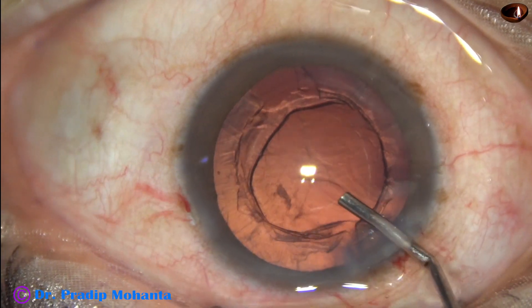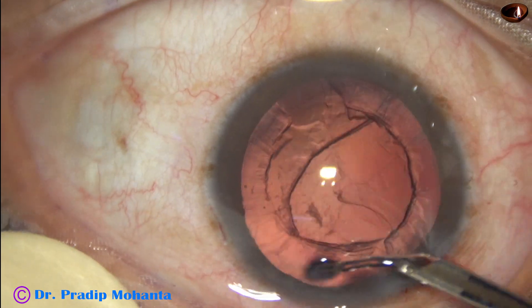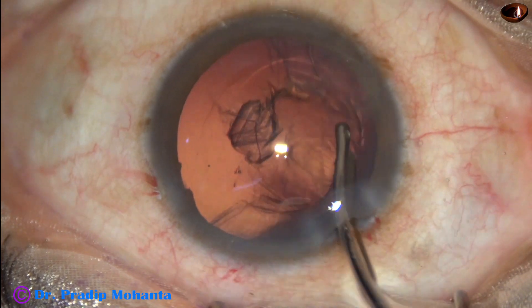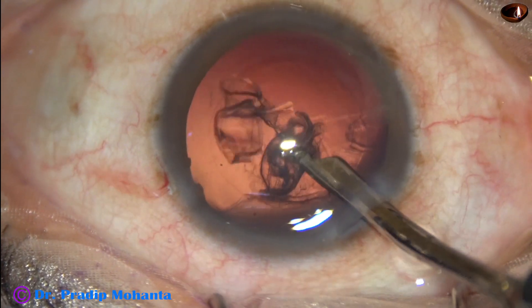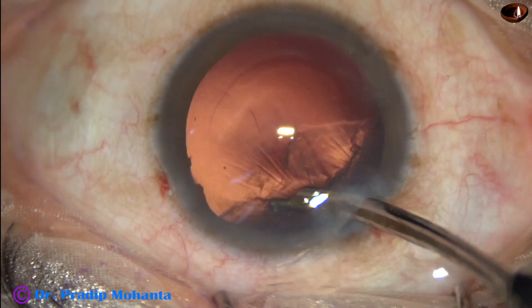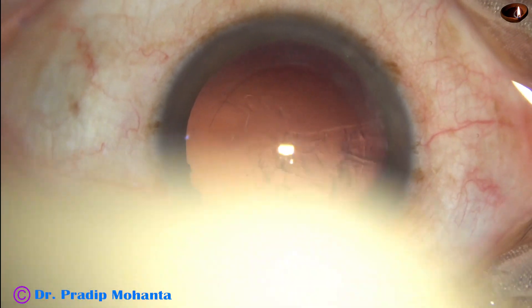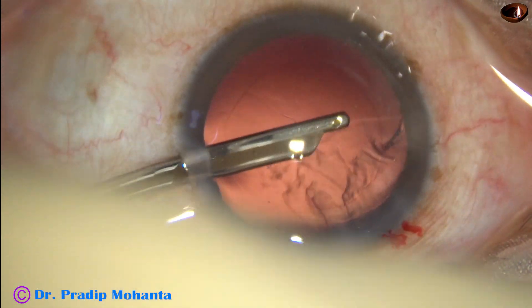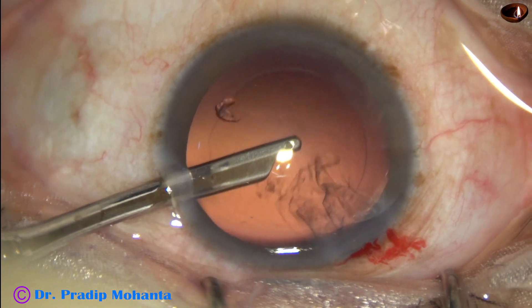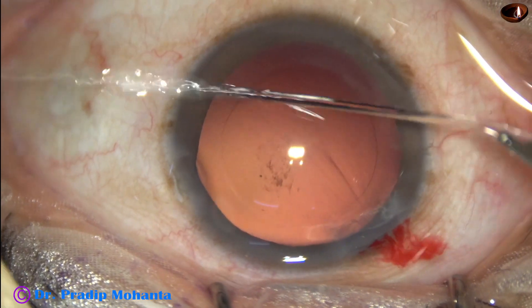Viscoelastic is used to fill up the capsular bag. Now a 23-gauge Simcoe cannula is being used for cortical cleanup. The Simcoe cannula is kept ready with a separate bottle of BSS. As I hand over the FACO handpiece, the assistant hands over this Simcoe cannula to me. So by the time she gets ready with bimanual irrigation aspiration, the cortical cleanup is almost done — it saves a lot of time.